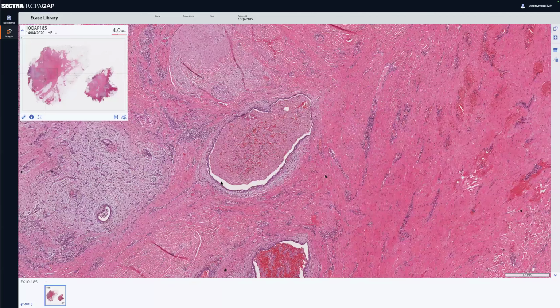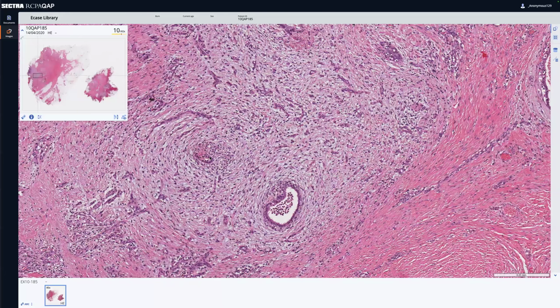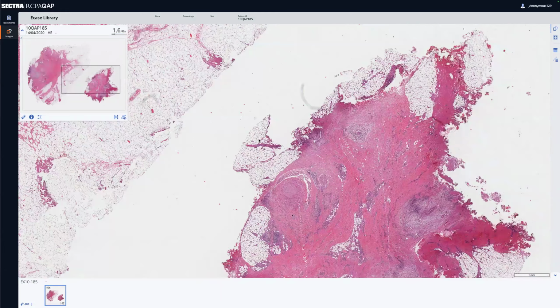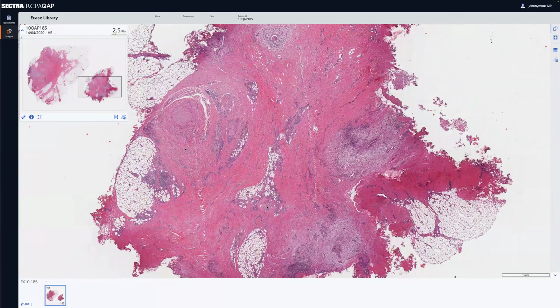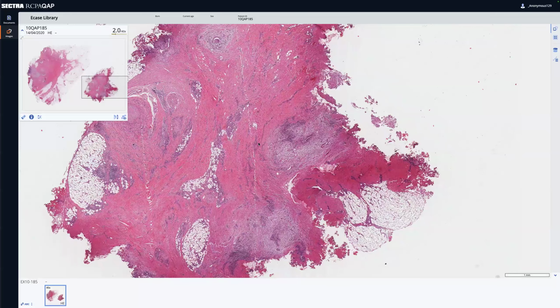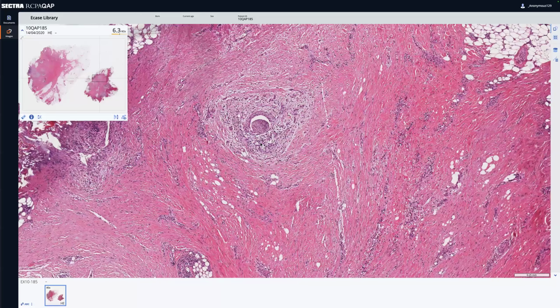So here we go. We've got loads of scarring here and it's been cut out. It's in the abdominal wall, so this is most likely to have come from somewhere like a scar from a hysterectomy. It's causing lots of chronic inflammation and fibrosis. And this is its problem. It causes lots of chronic inflammation and fibrosis everywhere it goes. And then the clinicians come in and take bits out and send them to us.